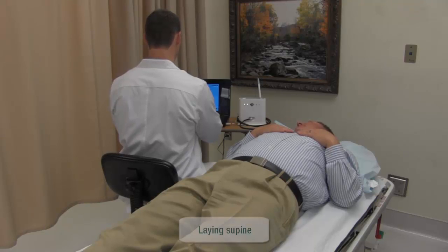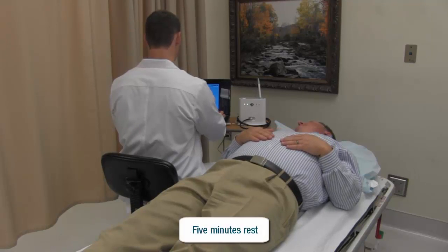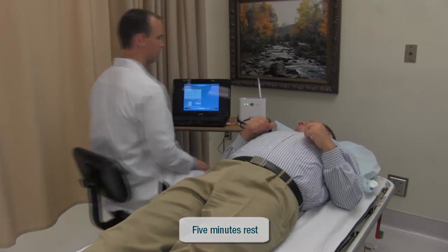To prepare for pulse wave velocity, the patient should be in the supine position and have rested for at least five minutes before beginning the assessment.